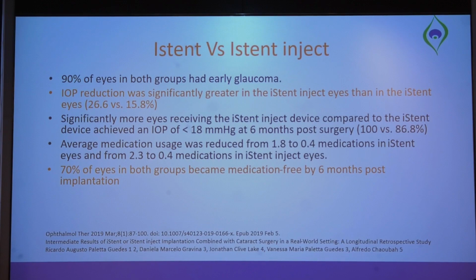And then comparing iStent with iStent inject, of course inject was better in reducing intraocular pressure. There was more reduction of drops in the iStent inject group, and both groups became medication free. Almost 70% of the eyes in both groups were medication free.